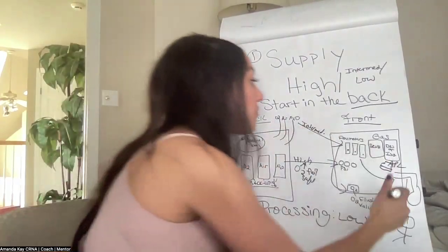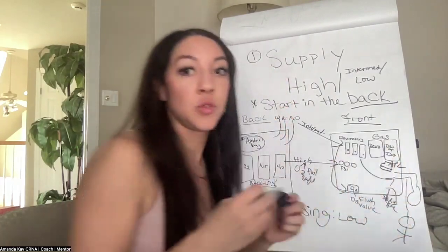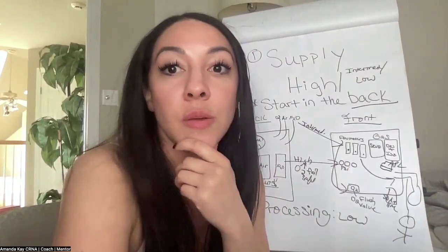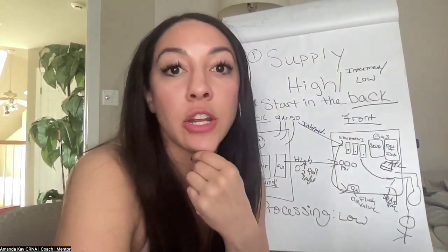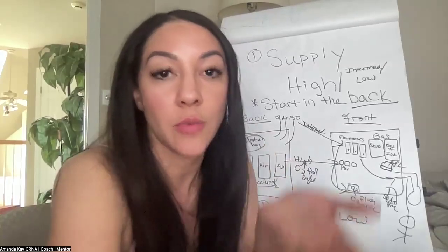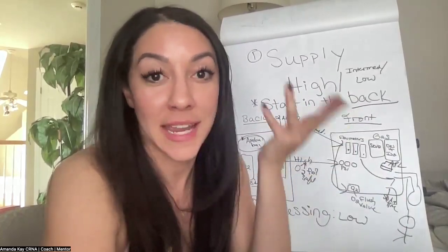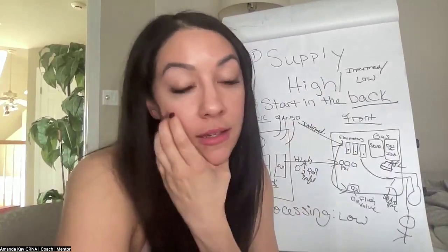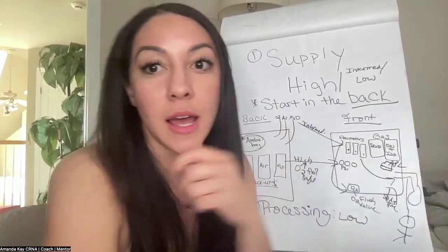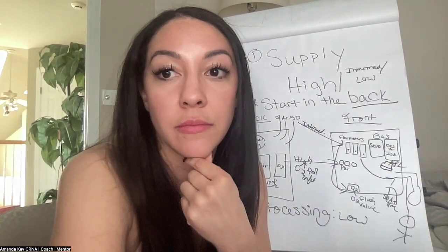Then we also have down here our soda lime absorbers. Make sure you know the equations for those for boards, but they will basically turn purple when they are exhausted. On your machine, you will see the FiCO2, which should literally be 0 to 2. That will start to creep up. So if your FiCO2 is alarming and it's like 11, 12, check your soda lime. They could be exhausted and they will be purple. Usually you pull it out and put a fresh one back in of soda lime, or CO2 absorbers, as it's also called.